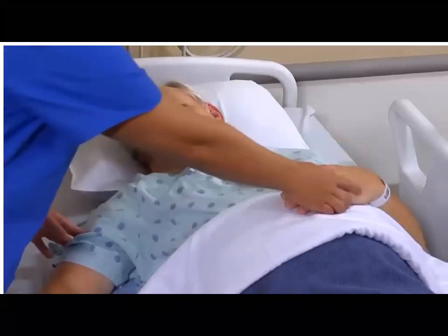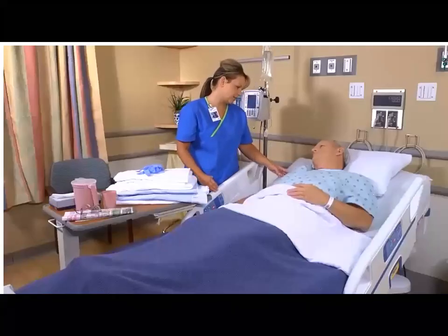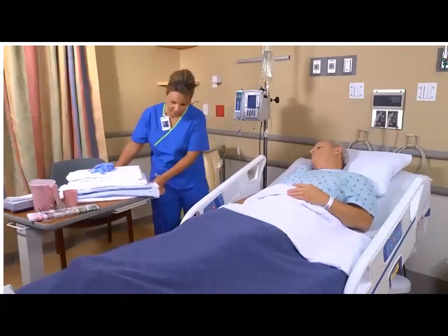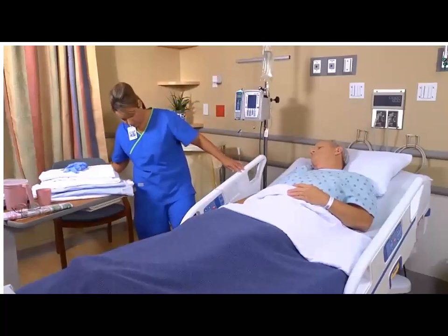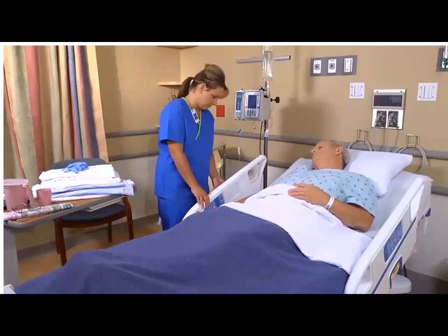Explain to the patient what you'd like to do. We're going to be changing your bed linens today since you're not able to get out of bed yet. Okay. And I'm going to change the linens with you still in the bed. Then check the floor for spills and make sure the wheels are in locked position. Assemble the linen on a clean, dry bedside table. The linen should be stacked in order of use.